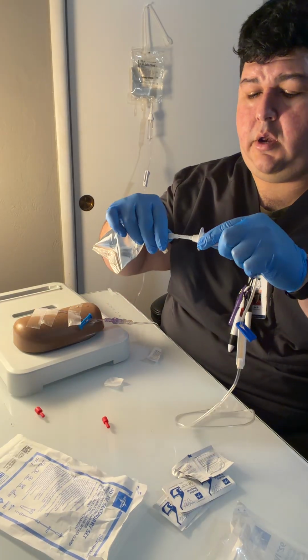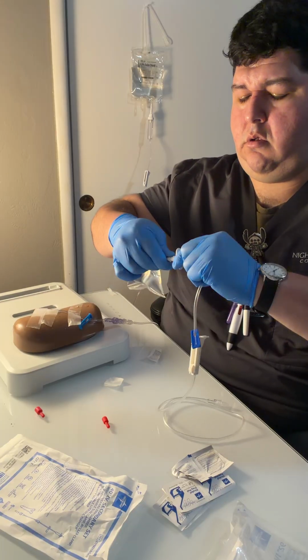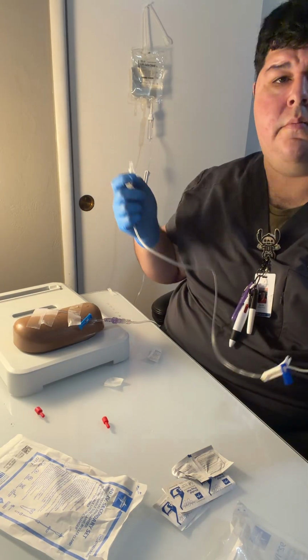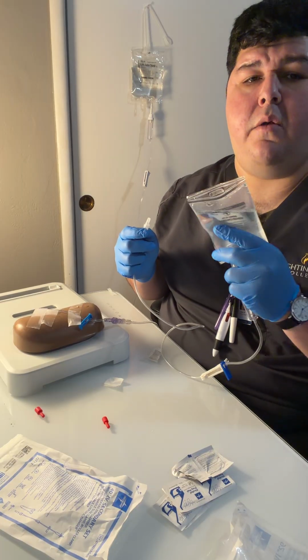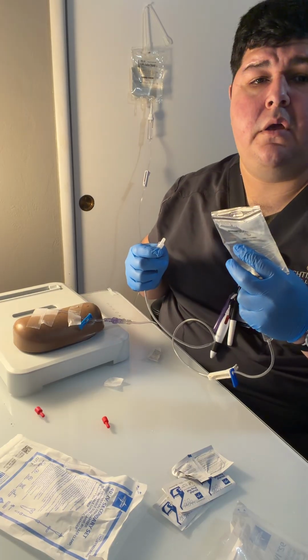Tip and insert it into the bag. Okay, just like so. We're going to go ahead and hang this one above our primary, so higher up. And then we're going to verify that both bags are at least 30 inches above the IV site.